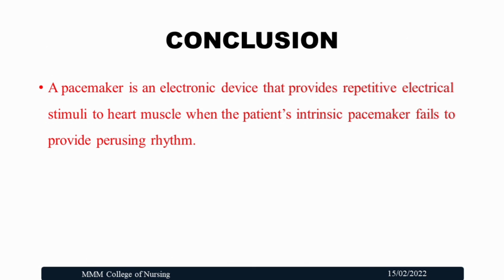In conclusion, a pacemaker is an electronic device that provides repetitive electrical stimulation to the heart muscle when the patient's intrinsic pacemaker fails to provide a pacing rhythm.